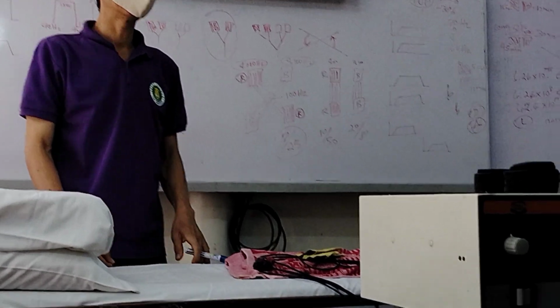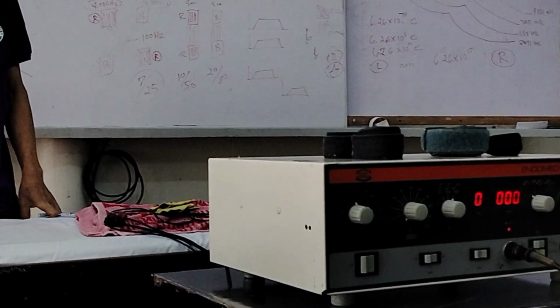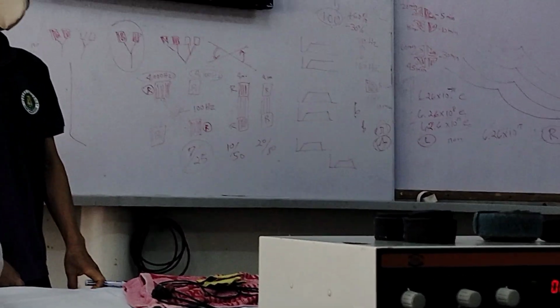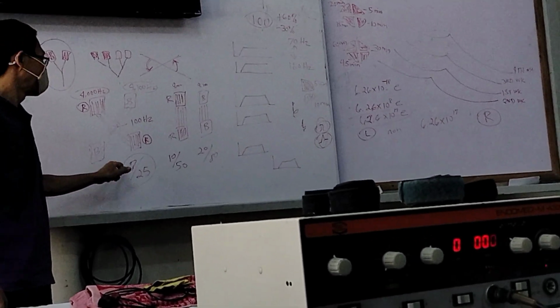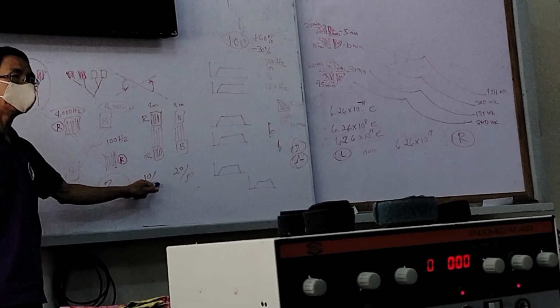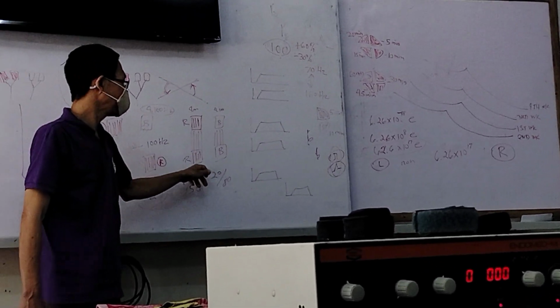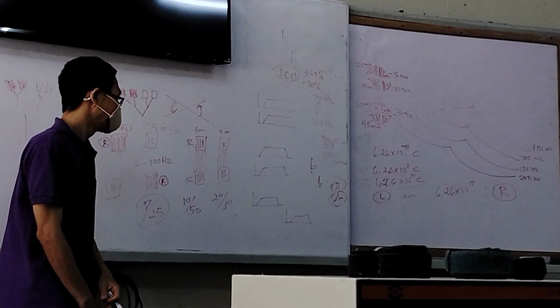The numerator is the duration in seconds for muscle contraction. Therefore, in 7/25, the muscle will contract for 7 seconds. In 10/50, the muscle will contract for 10 seconds. In 20/80, the muscle will contract for 20 seconds.